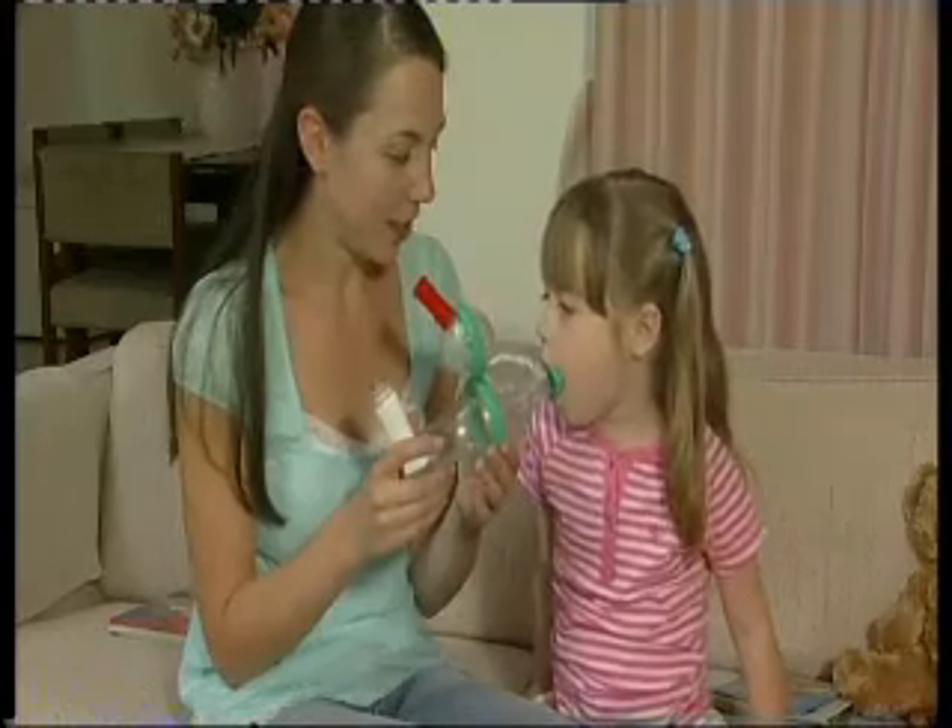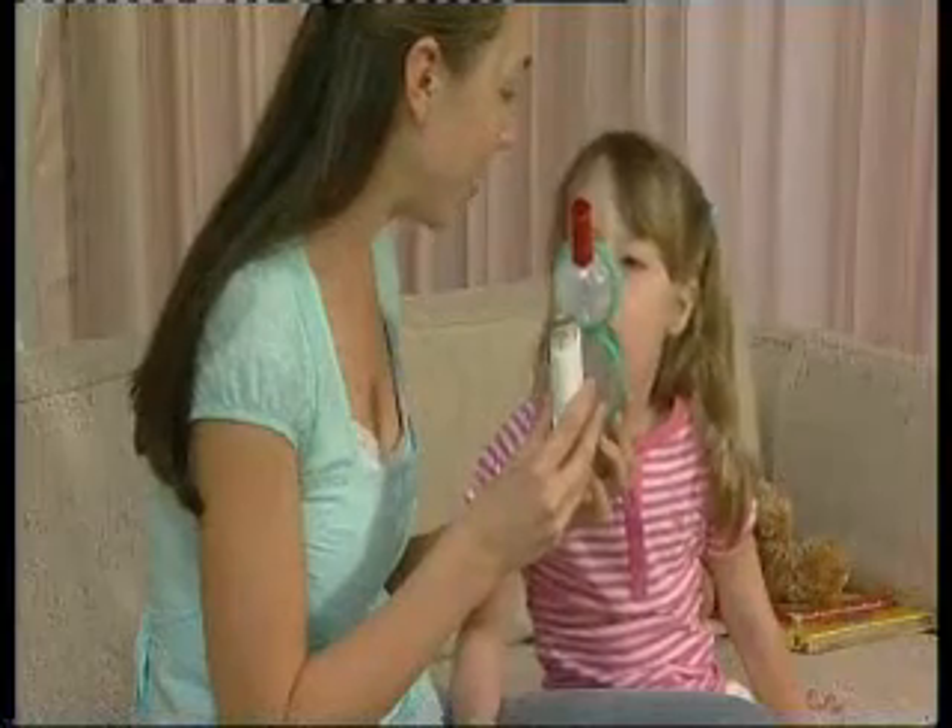Funhaler's unique colourful spinner and whistle provides a useful attraction, whilst encouraging your child to breathe correctly.